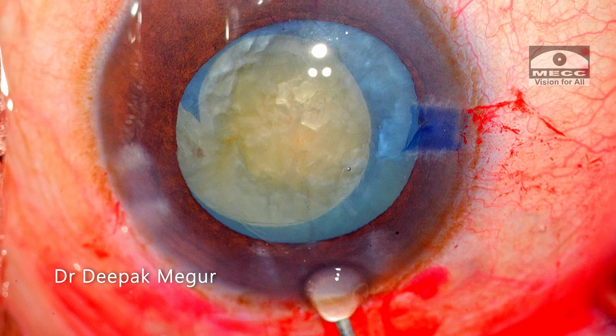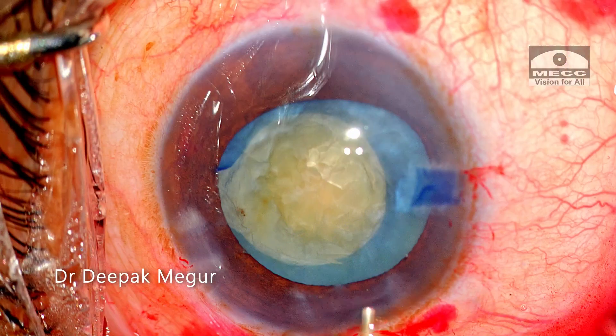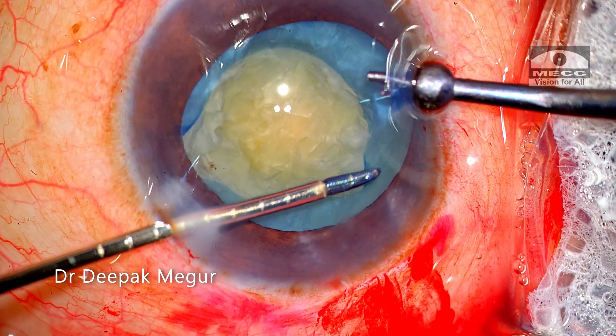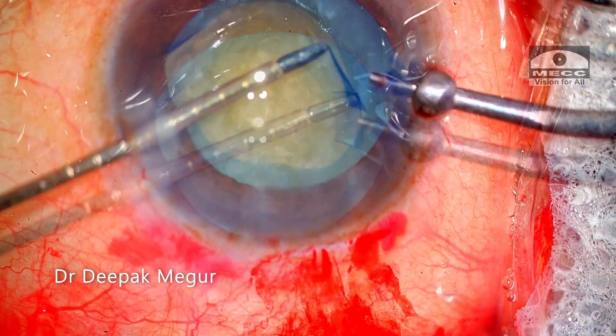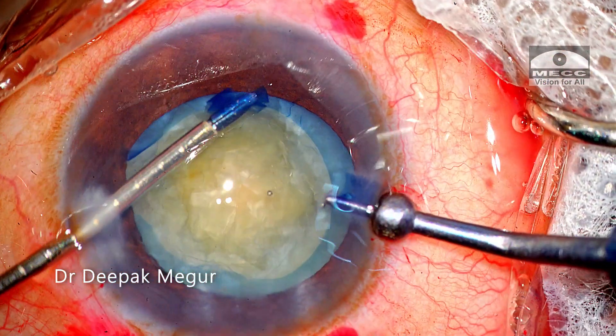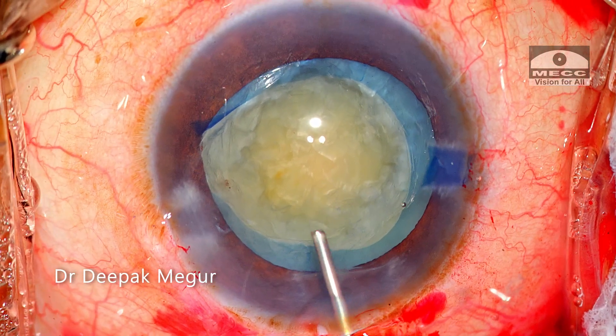So now we have a situation where the rhexis is not continuous — how do we go about it? The first thing I do is enlarge the rhexis by snipping at the margin in the other quadrant in the form of a tangential cut, so that I can enlarge the rhexis using micro-forceps. In this case, I have decided to go ahead with phaco emulsification.